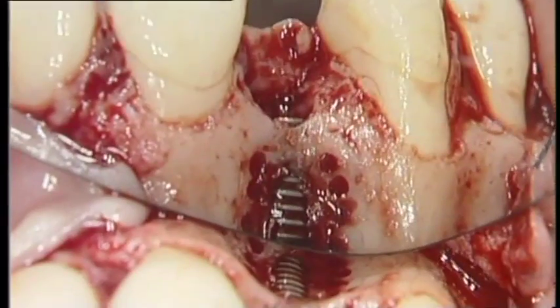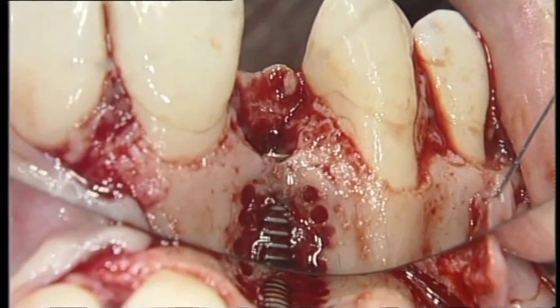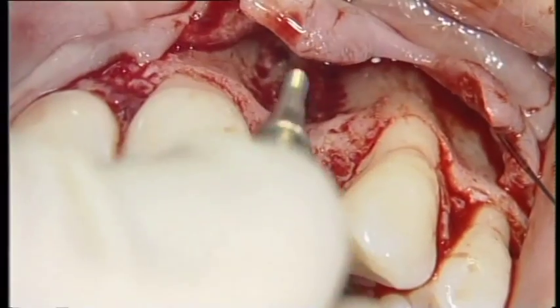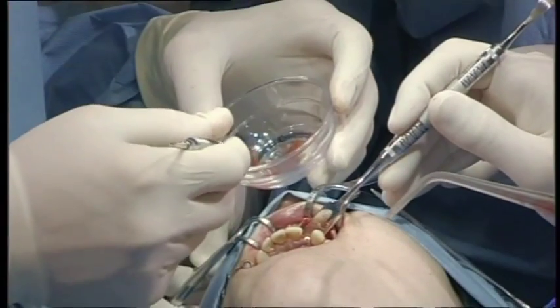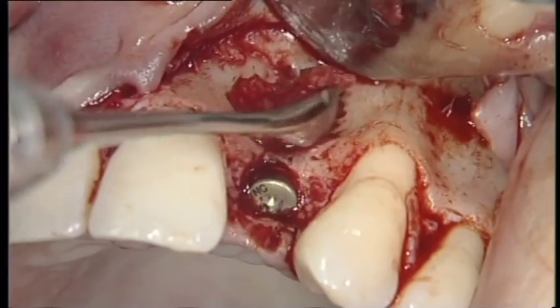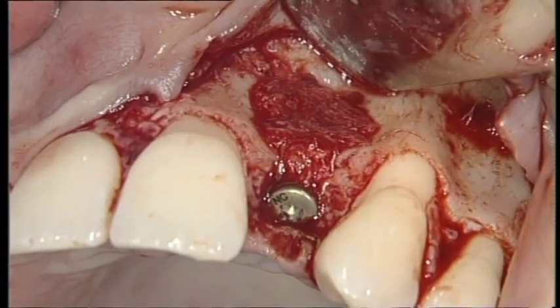The mirror view shows the fenestration defect and the level of the implant shoulder, which is positioned roughly 3 millimeters apical to the future soft tissue margin. A 2 millimeter bone-level healing cap is screwed into place. The locally harvested autogenous bone chips are applied directly onto the exposed implant surface. They will speed up new bone formation at the bone-implant interface.